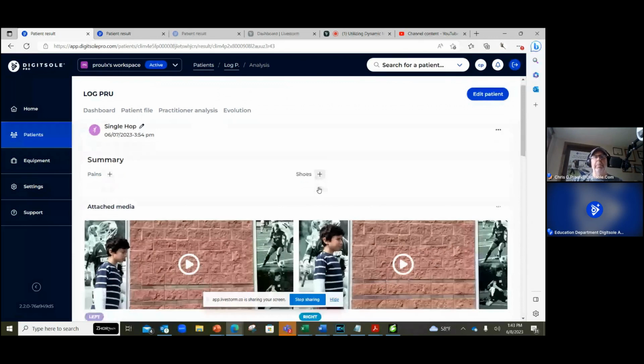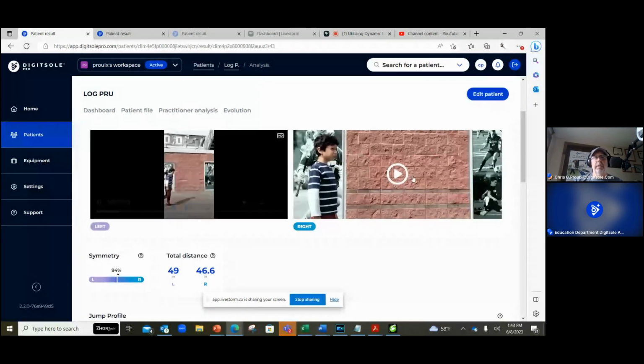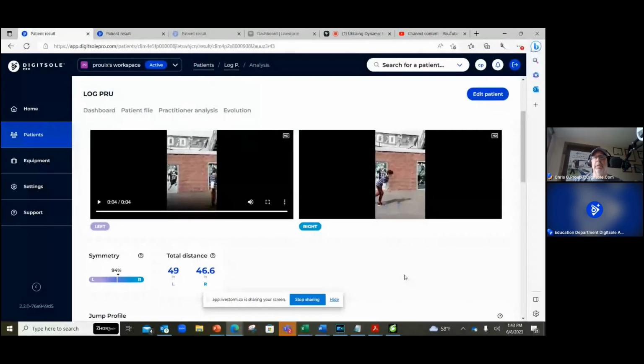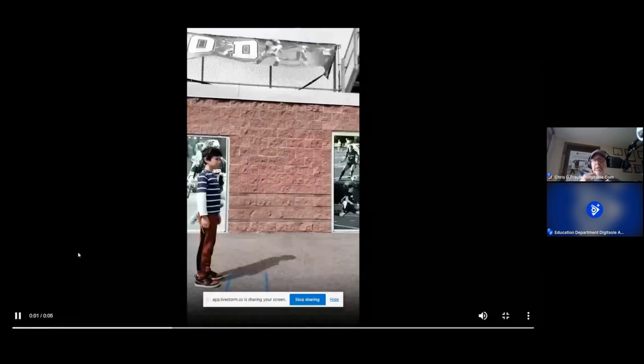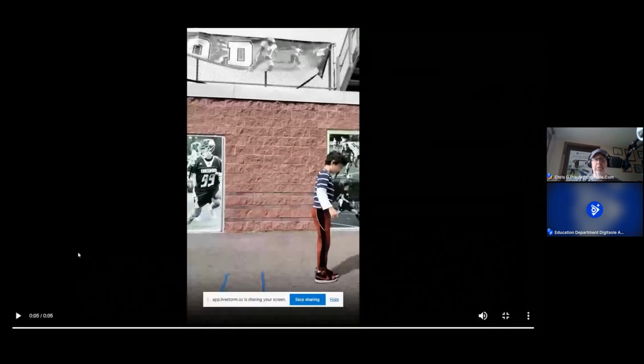So again, it populates both videos and we can run them at the same time if we want, right? So we start with the right leg or the left leg. You get to choose when you're running the test. I tend to choose whatever foot they say that they would normally kick a ball with. But I want you to watch this real close.